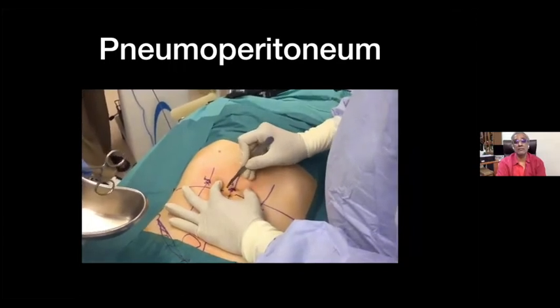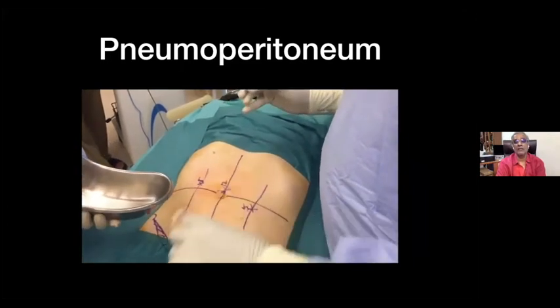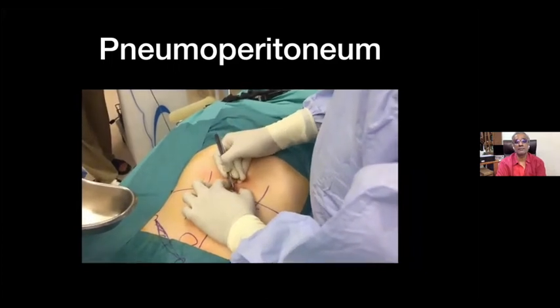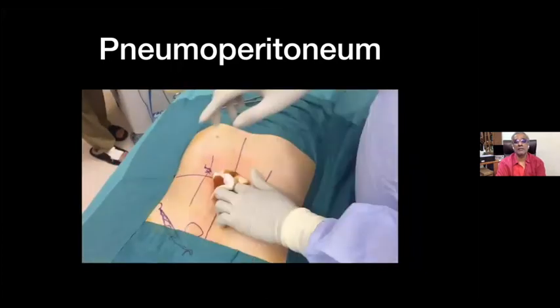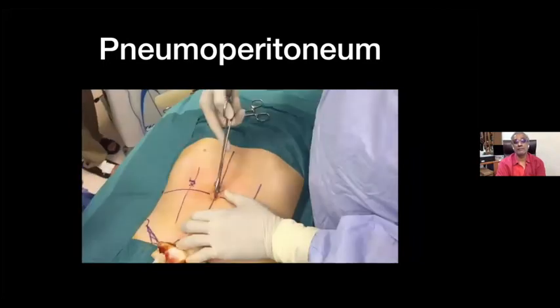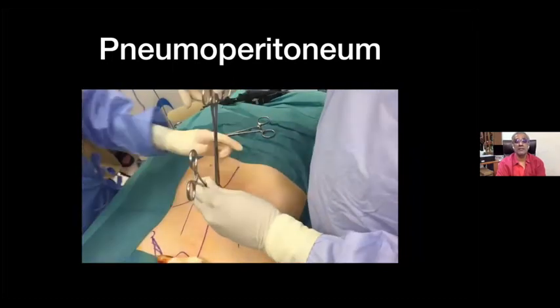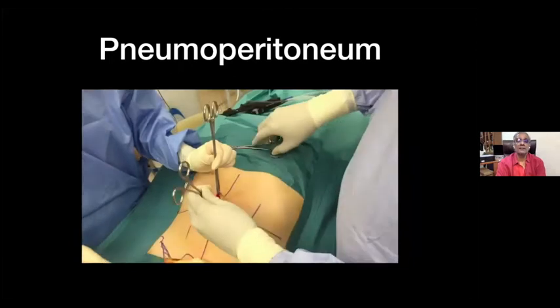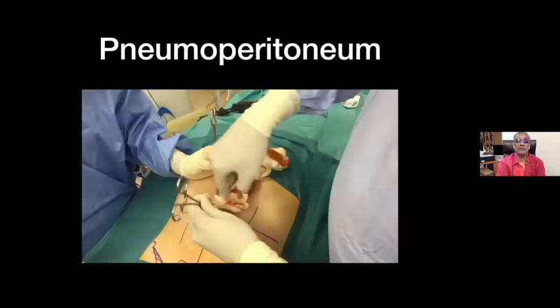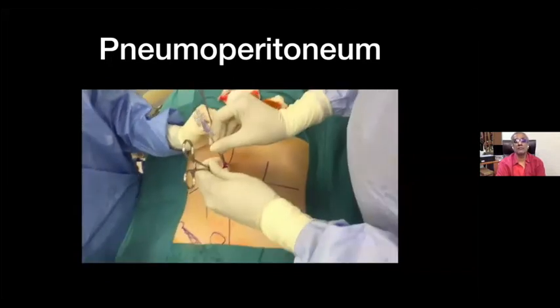This is what I use for my day-to-day work. I always give local anesthesia over the incision. Studies have shown that when you do this, it reduces post-operative pain. Then I use two little Allis forceps, grasp the edges, lift it up, and place the Veress needle. I do a little bit of dissection to look at the rectus. Then the Veress needle is held in a pen holding.